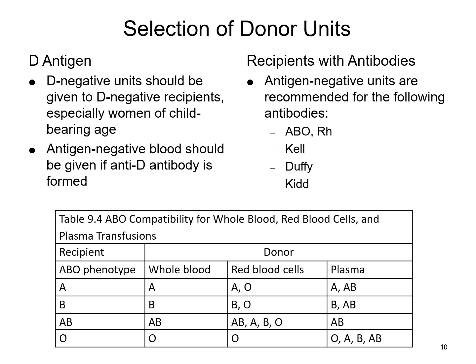There are some cases where, let's just say your O negative inventory is very low. This happens a lot. You may only have like 4 or 6 units left, so you're trying to reserve those for those women of childbearing age because you don't want to induce an anti-D, and you're also trying to conserve it for your patients who already have a known anti-D. And so in those situations you might have to do some deviations from standard policy, where like your men, you might give them Rh positive units with the idea that you could potentially stimulate an antibody.